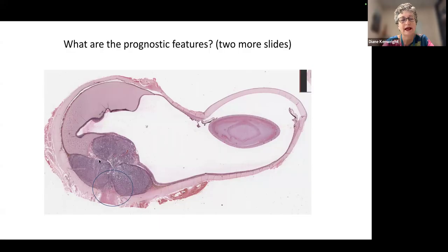Coming to the tumor, we can see it's got this kind of collar stud appearance again, where we've burst through Bruch's membrane here, and it may or may not involve the surface of the retina here. But worryingly, it's sited over the optic nerve, and we can see that there is probably early invasion of the optic nerve here.